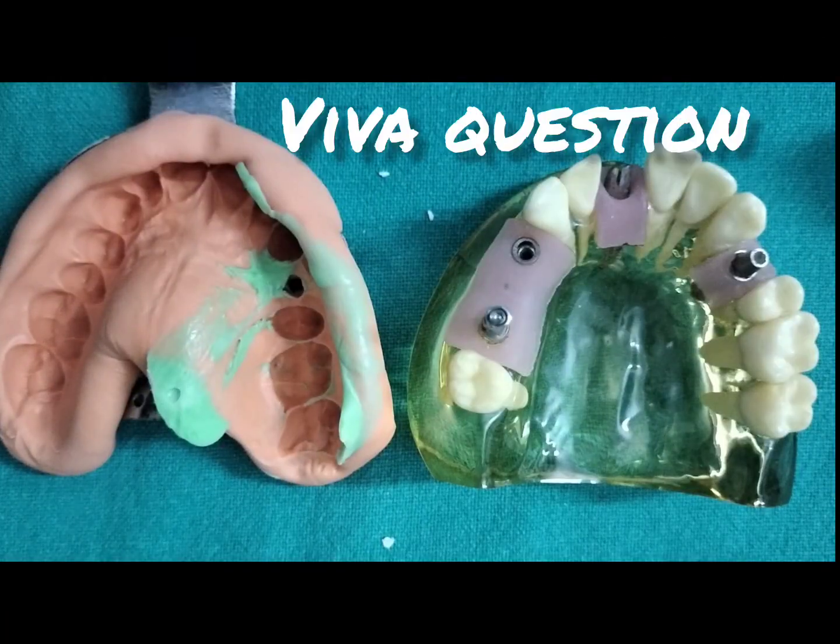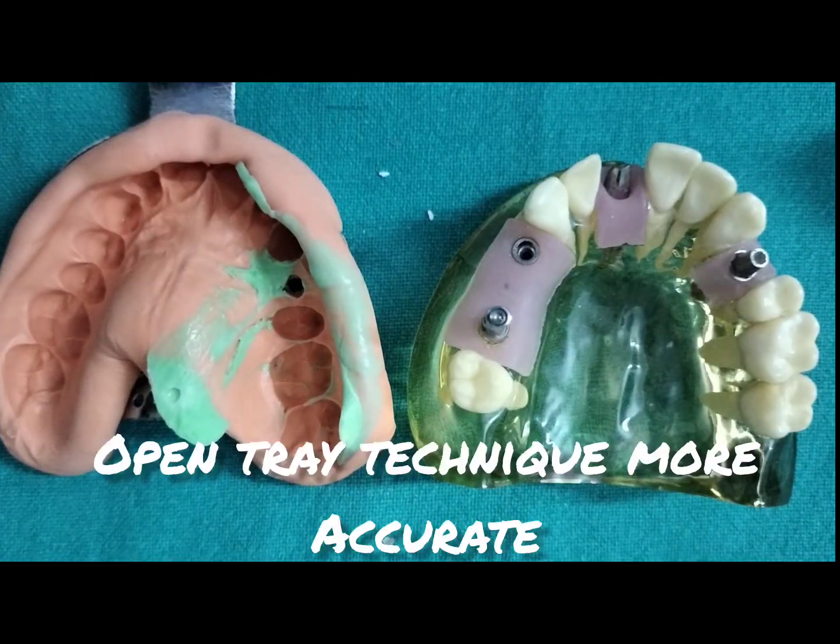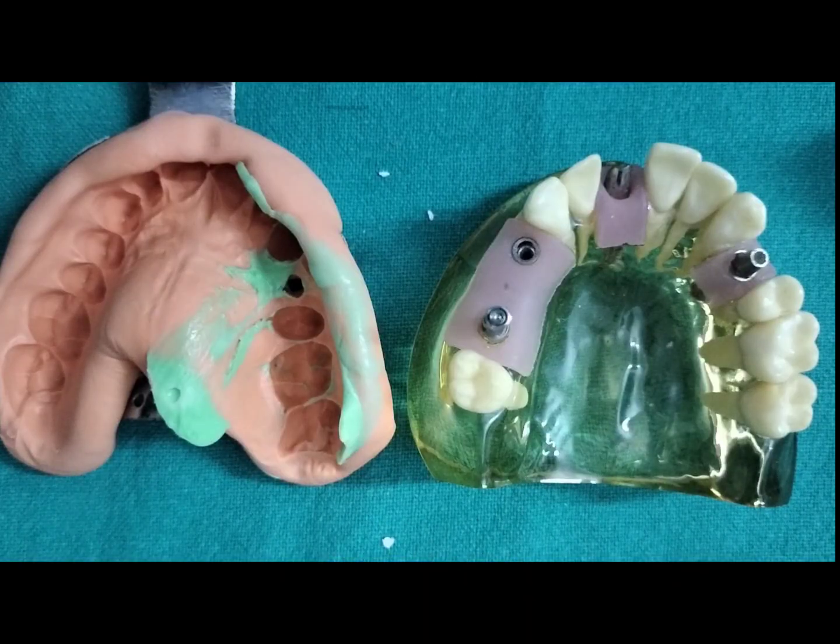Sometimes in an exam Viva they may ask which impression technique is more accurate. Now in this we will say that open tray impression technique is generally considered more accurate, especially when we talk about multiple implant cases, because we don't have to reposition the impression coping from the patient's mouth into the impression as we do in a closed tray technique. That is the reason open tray technique is generally considered more accurate.